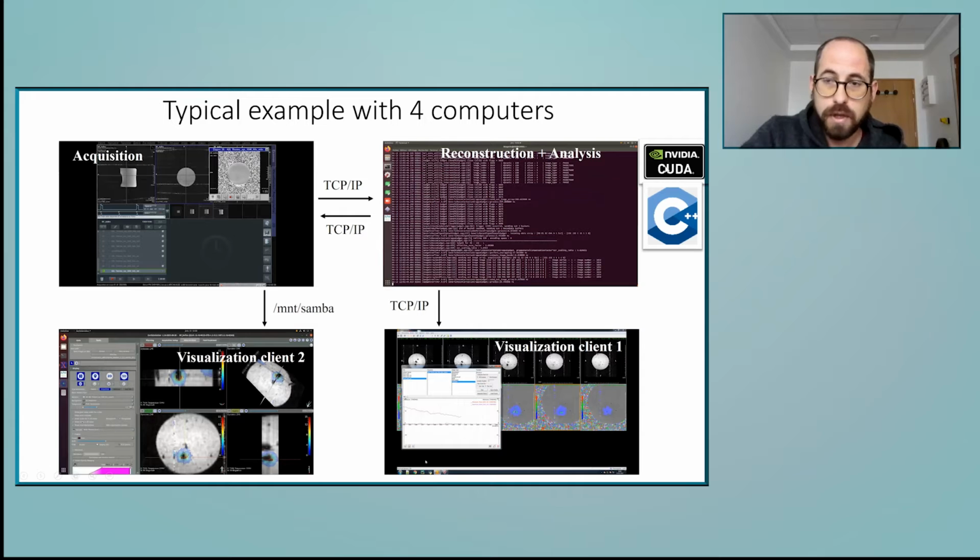So we use CUDA code, using the graphical unit of the computer. With the Gadgetron, it's like the masterpiece of the reconstruction, because it's connecting with the MRI, but it can also send information to other visualization software to display the temperature, or any other image.